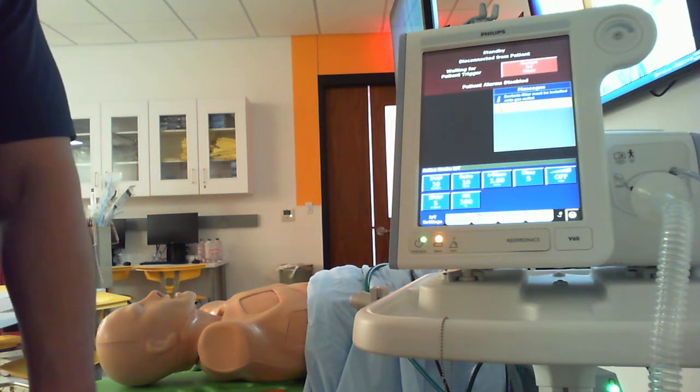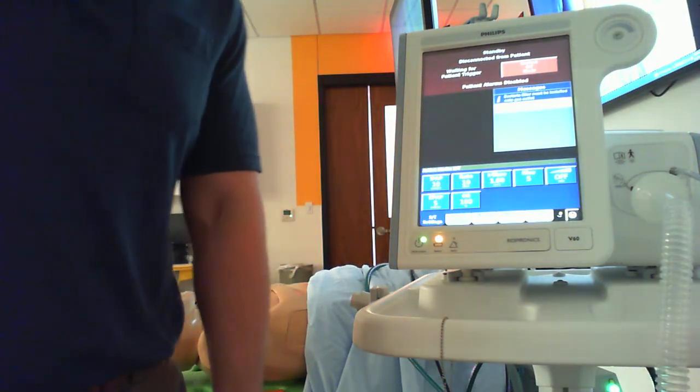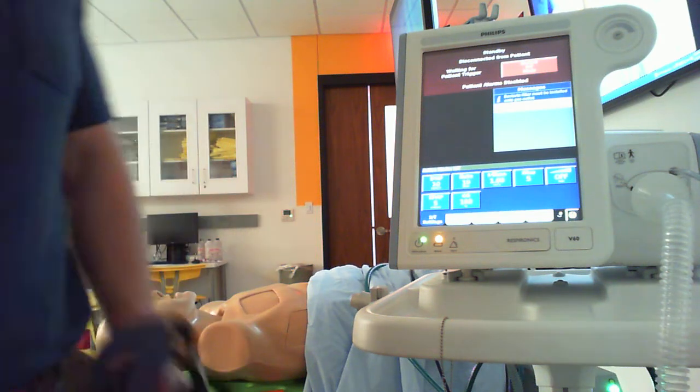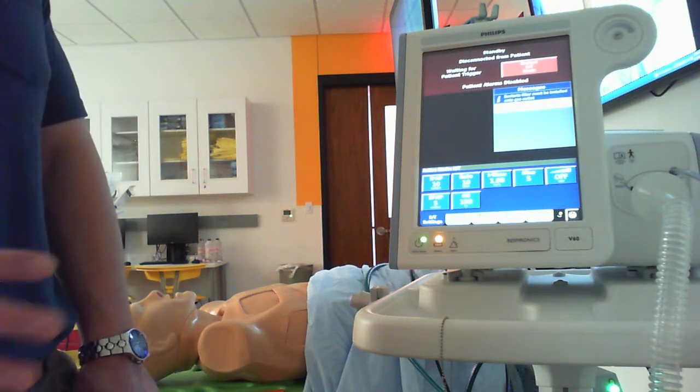When in doubt, you're better off to start at a high FiO2, or if you don't know a lot about the patient, starting them at 100 and quickly weaning down once you get them stabilized, all right? But if you have somebody with accurate pulse oximetry readings and they're on a current oxygen device, you can make some inferences and guesstimates, okay?